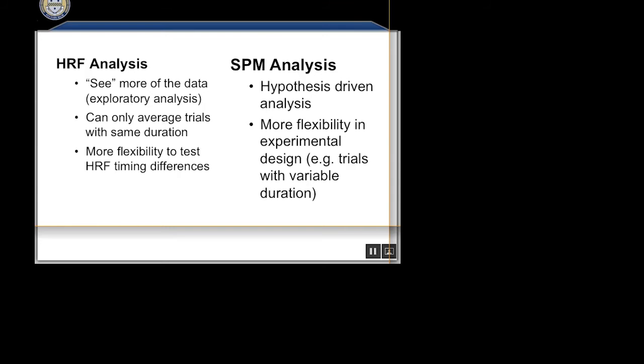Of, hey, I do kids. I don't know what the hemodynamic response looks like. I don't want to make assumptions like that. It turns out that the way to think about a canonical model is not as imposing a specific shape. It's imposing a hypothesis. It's imposing the shape of what time window you want to use, such that if you use the wrong time window or the wrong shape, it's equivalent to just picking the wrong time window.